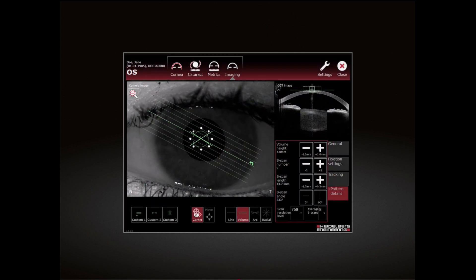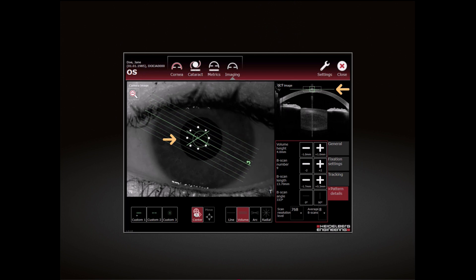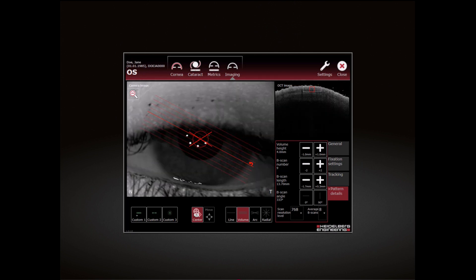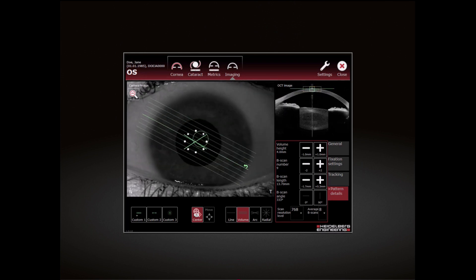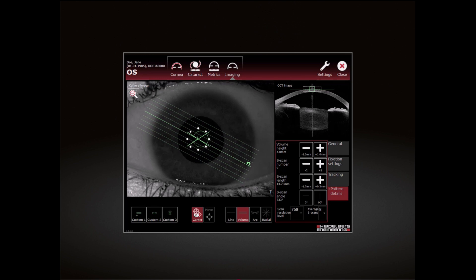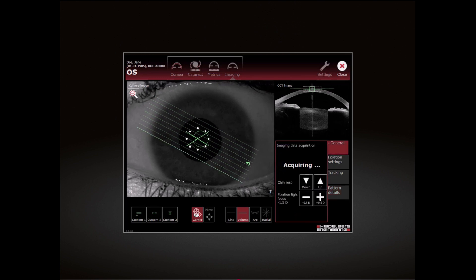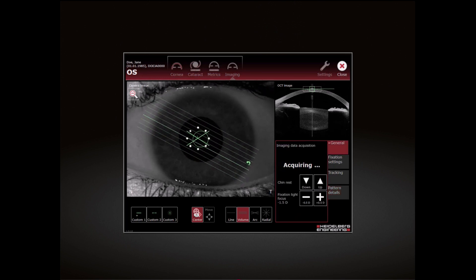Align the camera so that the cornea and the corneal reflex are within the dashed box. Ask the patient to blink and then to refrain from blinking for a few seconds. Realign the camera if needed and press the joystick button to start the acquisition.